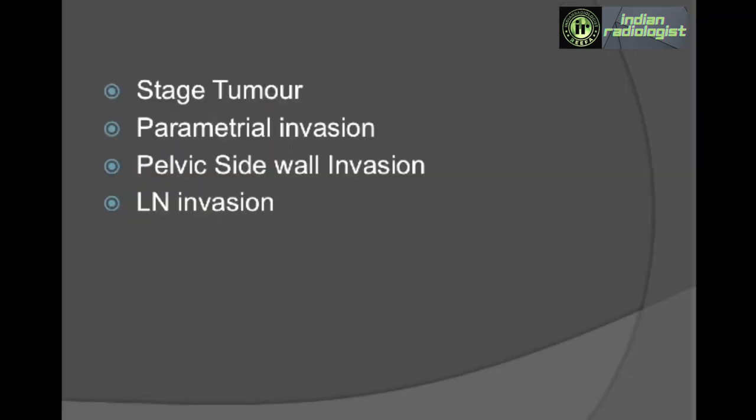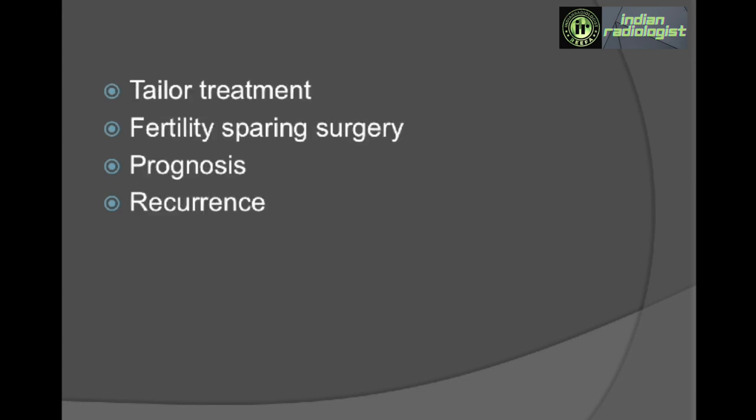Now, MRI also helps to assess the tumor size, any parametrial invasion, any pelvic sidewall invasion or lymph node invasion. And all these are important in staging the tumor and in prognosticating the patient. This also is very, very important in fertility sparing surgery, which is considered in some patients with cervical cancers who are young, and we will be talking about this in the subsequent lecture.